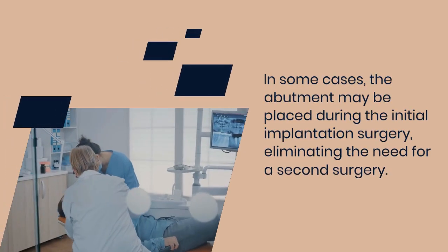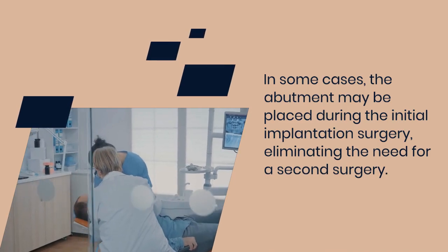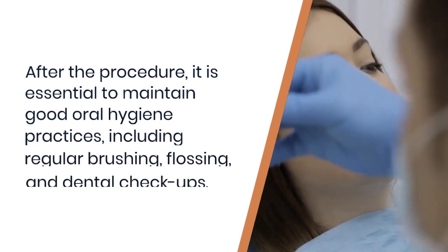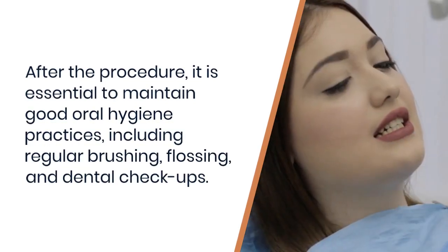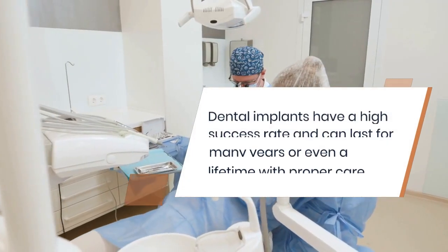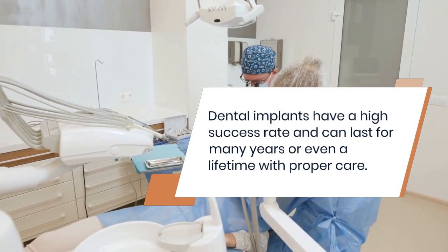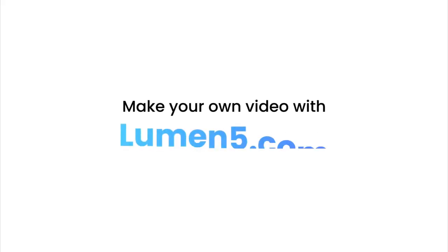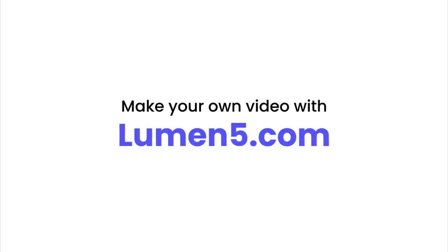After the procedure, it is essential to maintain good oral hygiene practices, including regular brushing, flossing, and dental check-ups. Dental implants have a high success rate and can last for many years or even a lifetime with proper care. Dental implantation is a surgical procedure used to replace missing teeth with artificial tooth roots made of biocompatible material.